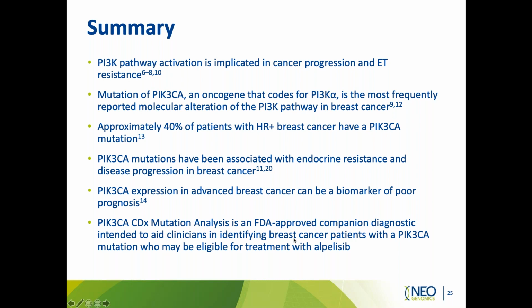And expression in advanced breast cancer may be a biomarker of poor prognosis and is certainly associated with other markers of aggressive disease. And specifically, the PIK3CA companion diagnostic mutation analysis, QIAGEN, is an FDA-approved companion diagnostic intended to aid clinicians in identifying breast cancer patients with a PIK3CA mutation who may be eligible for treatment with alpelisib. Next.